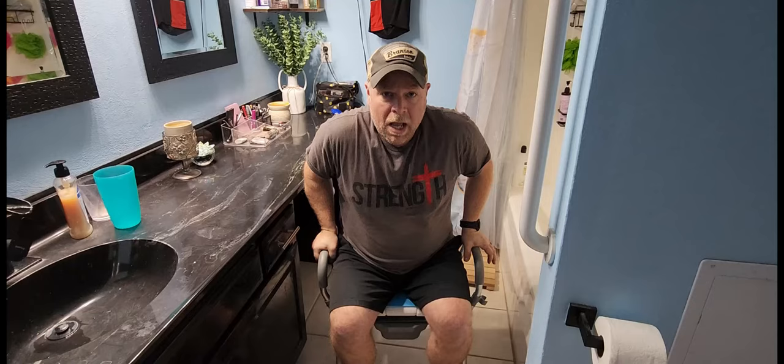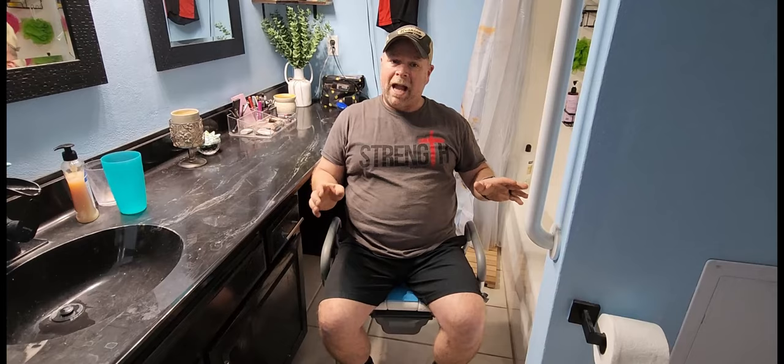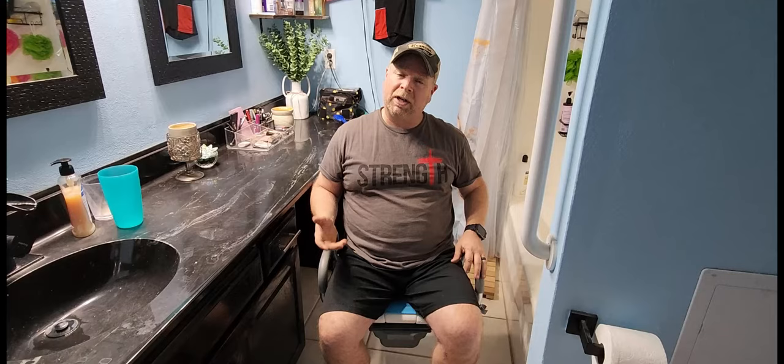It's very comforting to know that my mother-in-law is going to be safe using this commode or shower chair however she chooses. The backrest is really strong, and it's going to be really good as she recovers from her knee surgery. Whatever you may have going on that requires a shower chair and commode, this one right here is a really nice one that I would definitely recommend.